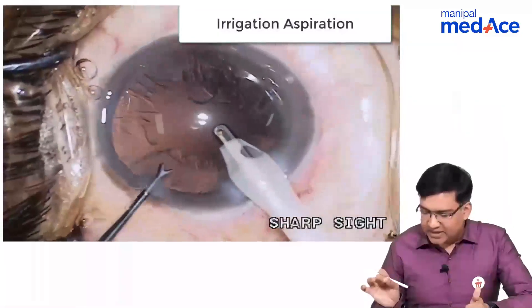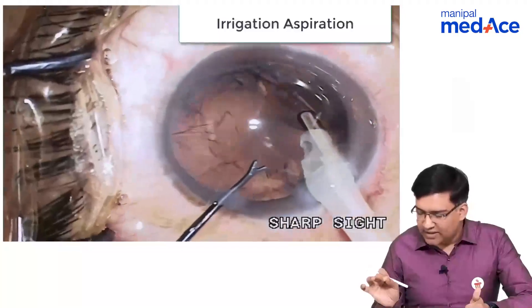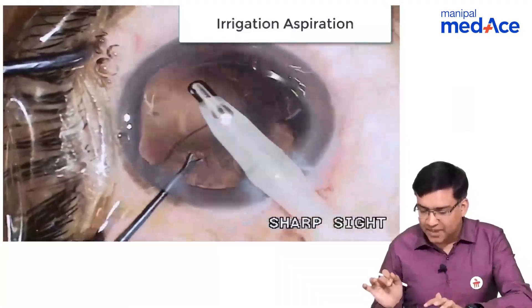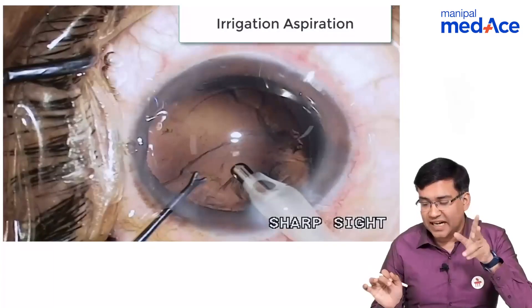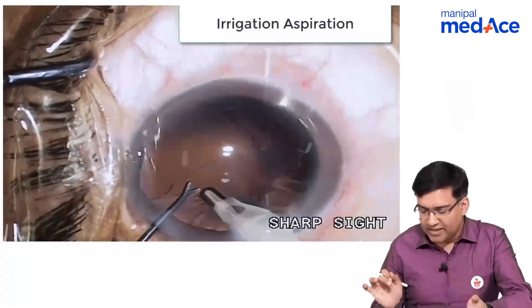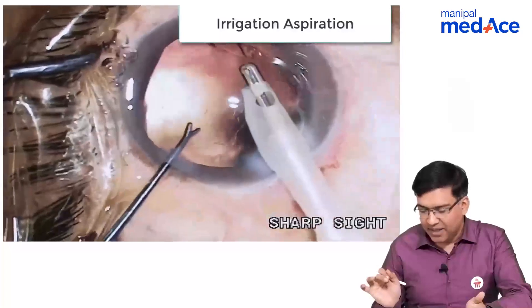After this is done, the next step is irrigation and aspiration. Whatever subcortical material is left is removed with the aspiration probe. Remember, the same aspiration probe is used in congenital cataract — we do not use the phacoemulsification probe, only this aspiration probe. We have removed all the strands and the remaining material.